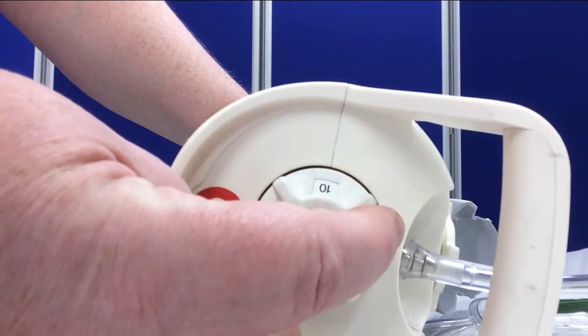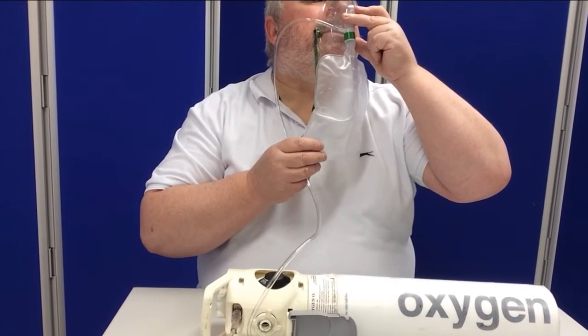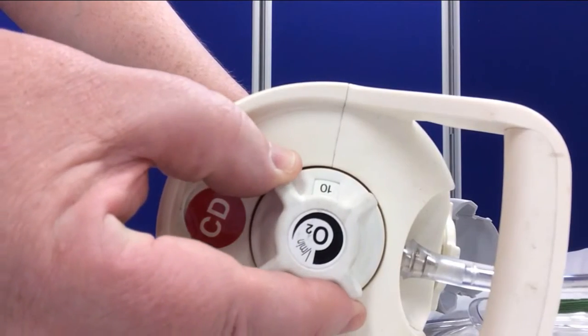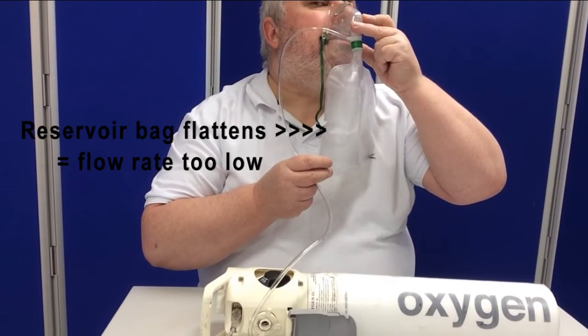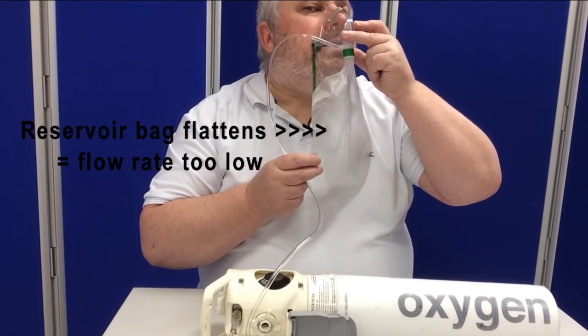As you can see, once it reached 8 litres per minute the bag completely deflated and I was just breathing what air was left in the mask. So the lowest level that was suitable for me was in fact 10 litres.